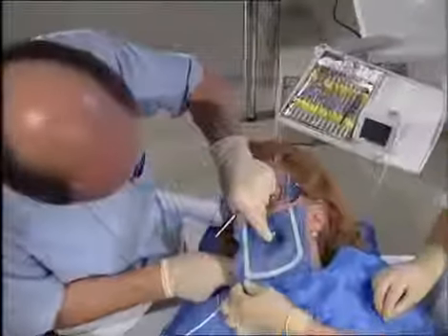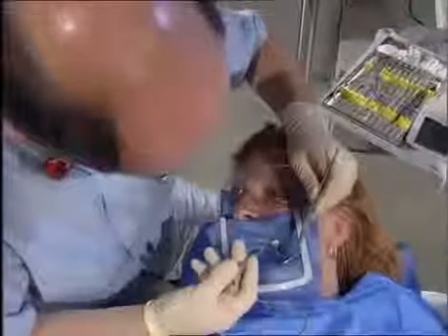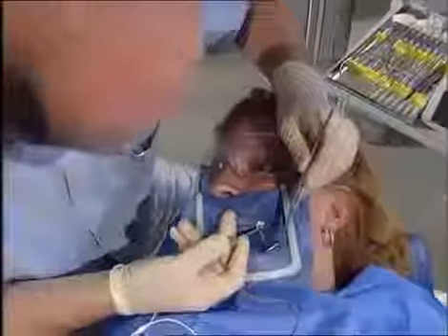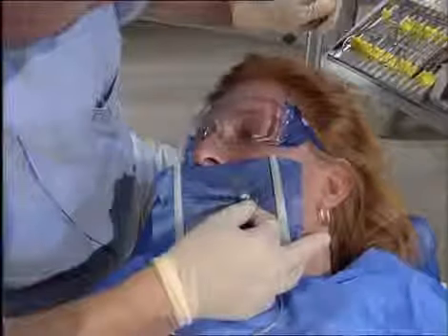In order to avoid over-instrumentation, the length of the root canal instruments must be checked carefully. Modern apex locators measure the electrical impedance between the file and the mucosa. These devices provide accurate measurements to within 0.5 millimeters of the apex. The position of the root canal instrument is displayed on a screen, as well as acoustically.